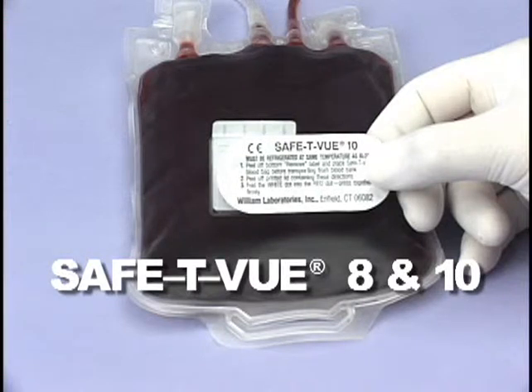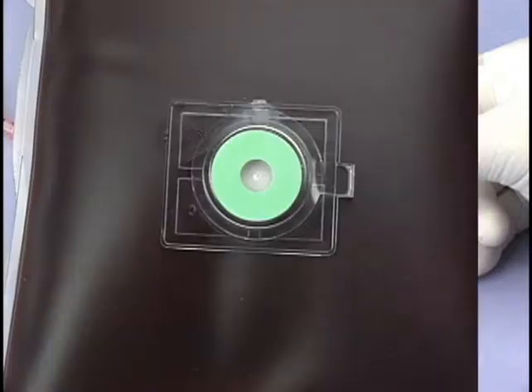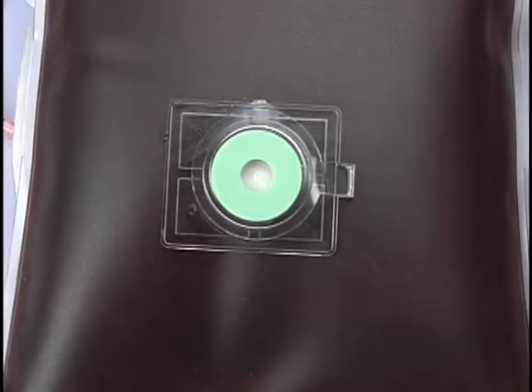Safety View 10 and Safety View 8 are non-reversible temperature indicators that change color from white to red when blood reaches the indicator temperature. As long as the indicator remains white, blood may safely be reissued.